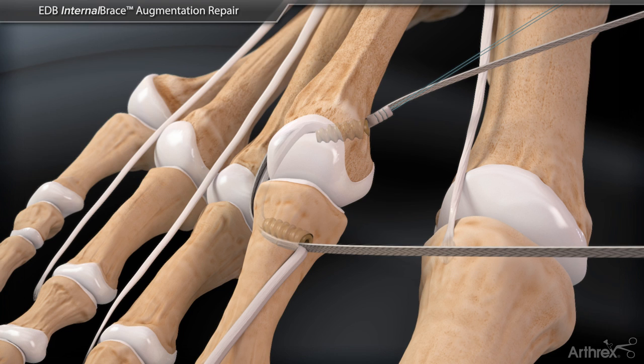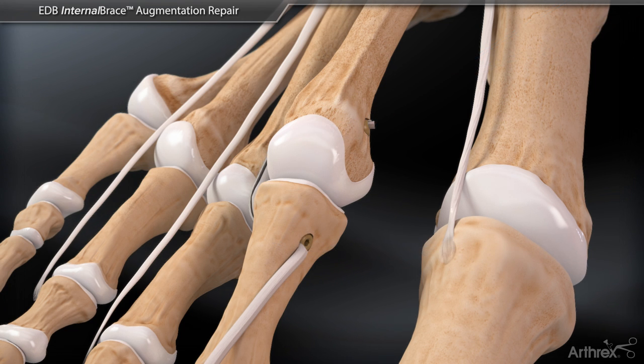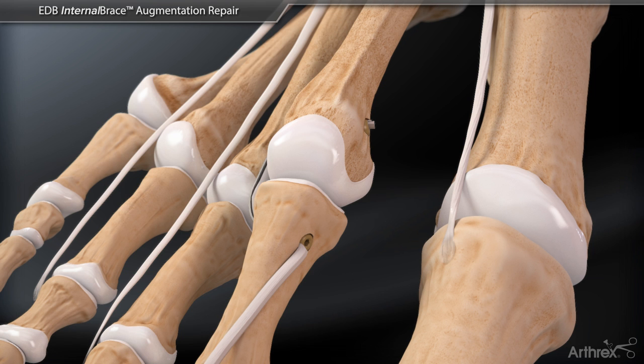This recreates the deficient lateral collateral ligament. The excess labral tape suture and EDB tendon are cut flush medially at the metatarsal head and the previously tagged extensor digitorum longus tendon ends are repaired appropriately. This completes the repair.